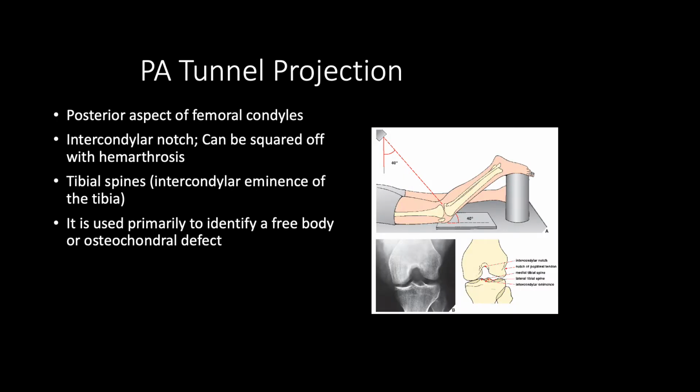We can do the tunnel projection. So the patient's lying prone with the film underneath the knee here. You see a projection of the x-ray beam here.